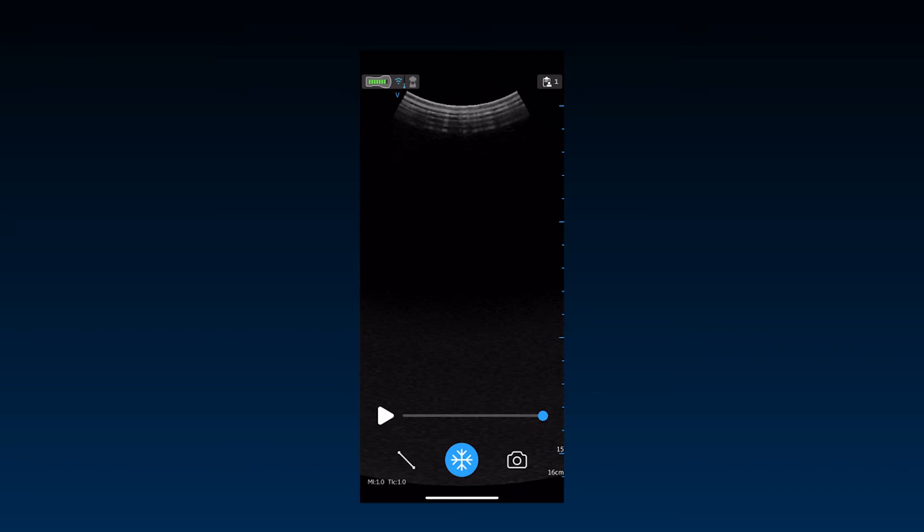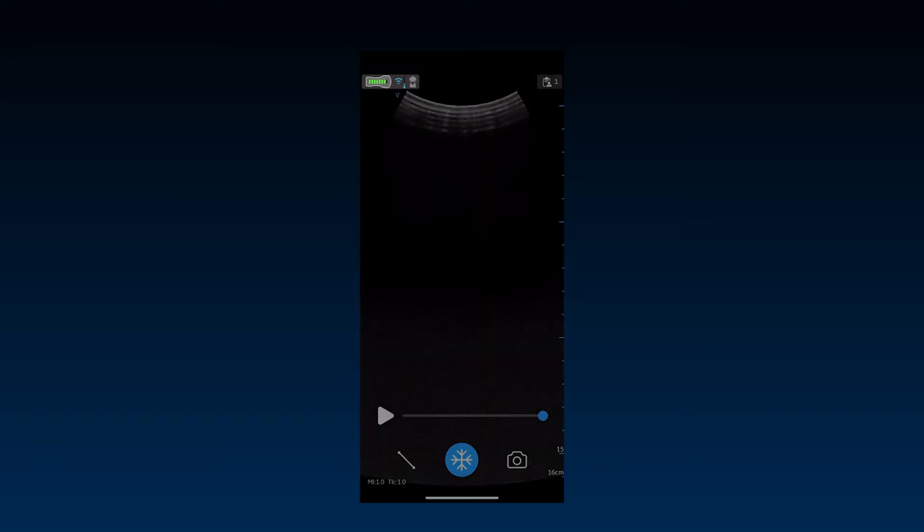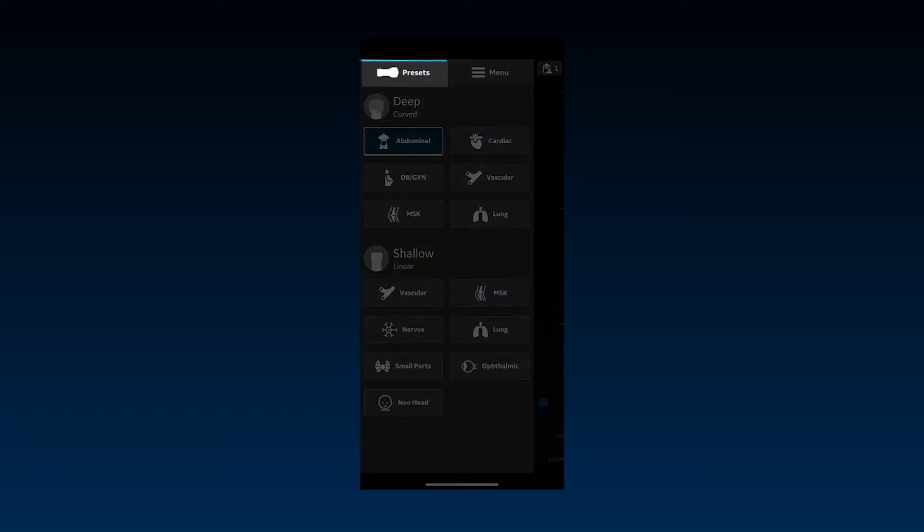Let's see how to configure and customize your vScan Air system. The left upper button on the app opens a panel to select a preset or go into a system menu by pushing the appropriate tab.